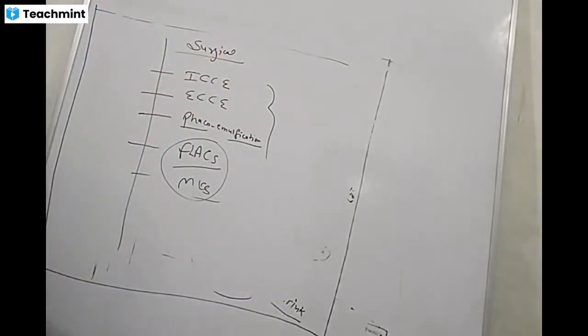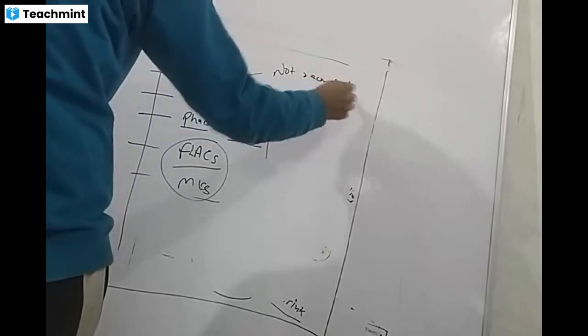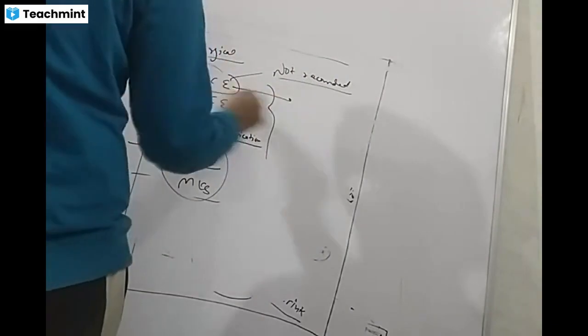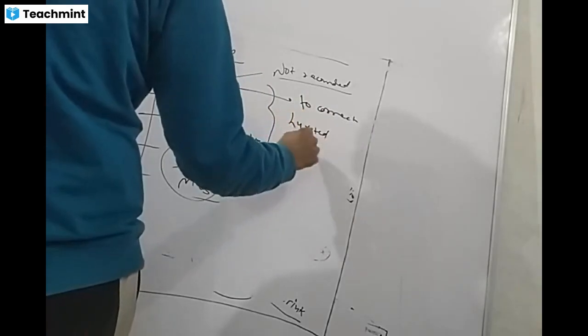These are the procedures; the intracapsular one is not recommended for cataract surgery. Only one indication is to correct a luxated lens.